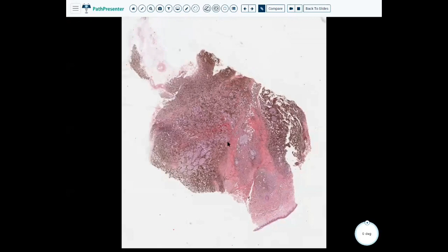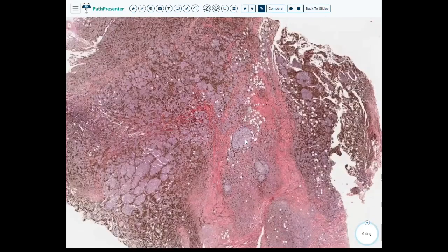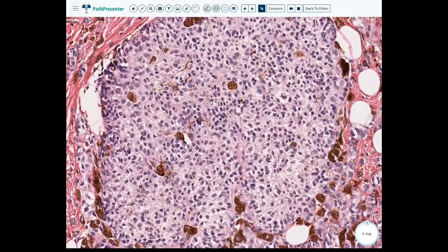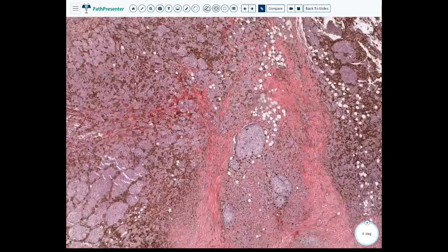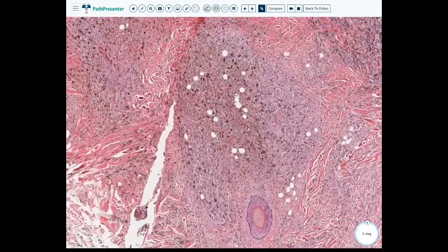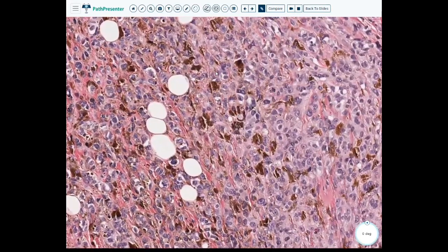Case 16. So what catches our eye is all this intense pigmentation. We have a lot of cellular, okay, as I just jump right in, our epidermis here, and then this intense pigmentation.